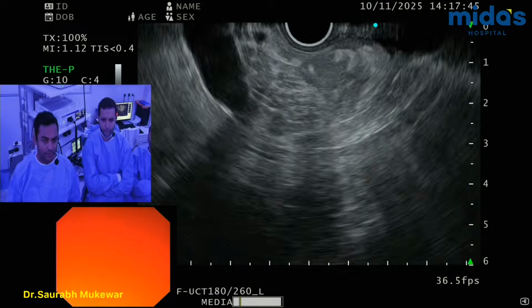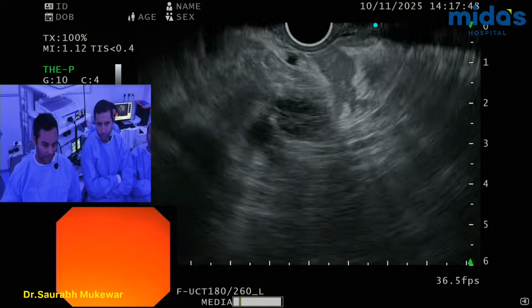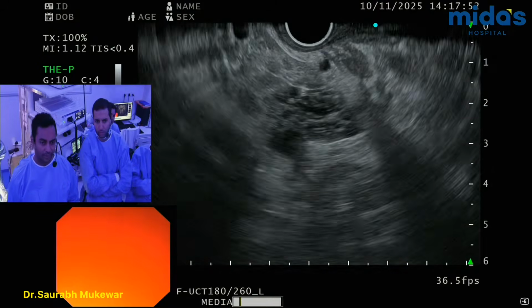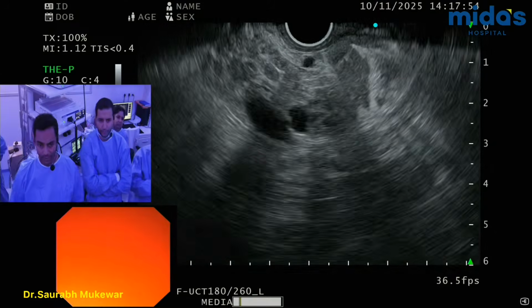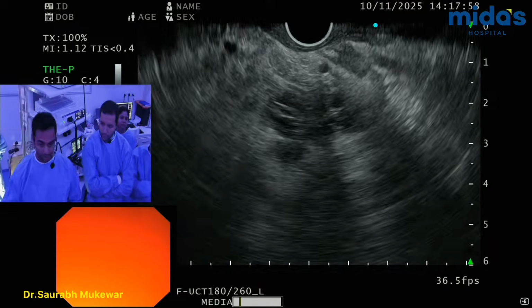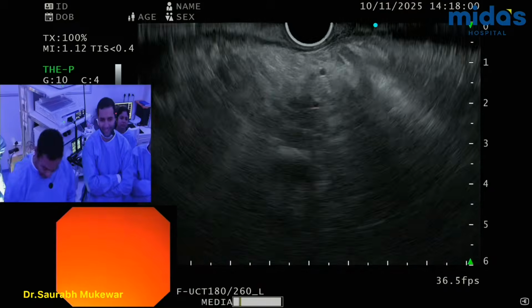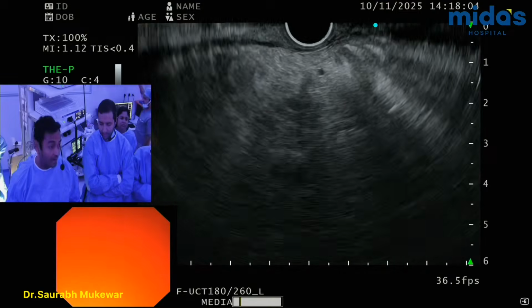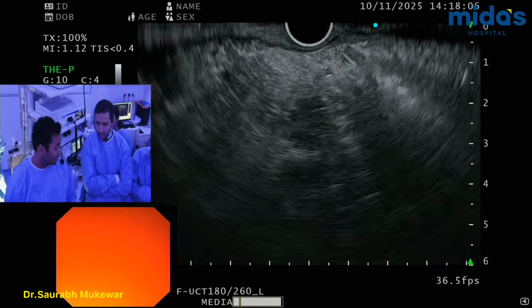I would just observe it. I don't expect it to increase. Yeah. Probably a little bit of venous blood and it'll stop. It was controlled, so it's fine. Yeah. Very rarely, now I've been 10 years I've been doing FNBs. I've had one time when a patient had to go to IR for embolization and that patient was on day 5 of Plavix. Okay.